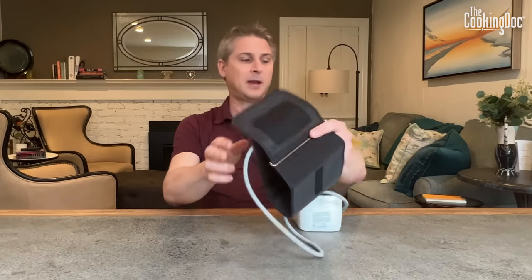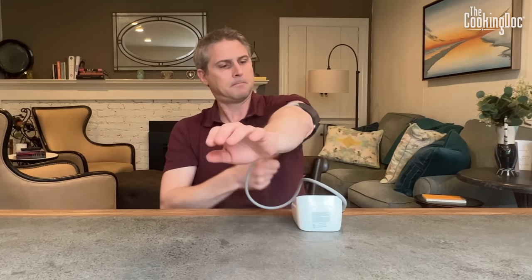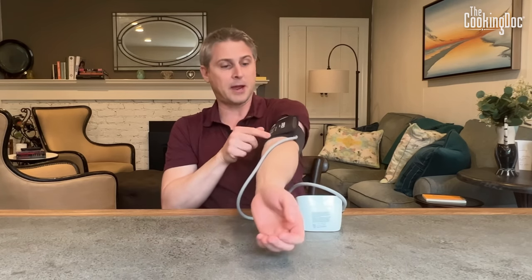Then you want to get a blood pressure cuff — and you want an upper arm cuff. You don't want one that goes around your forearm; those are not as accurate as the ones that go around your upper arm. I've got one here today — this is an Omron blood pressure cuff. I'm going to make sure there's no shirt or jacket in the way, and I'm going to put this around my arm just above the elbow.